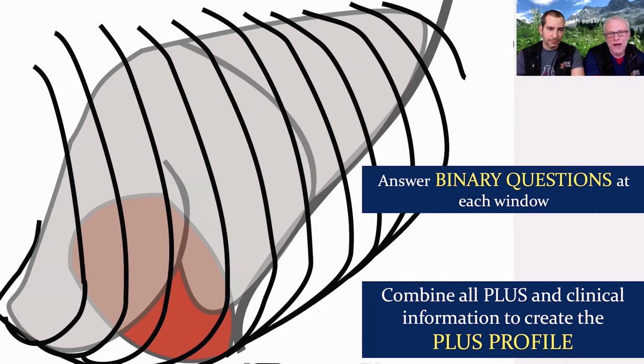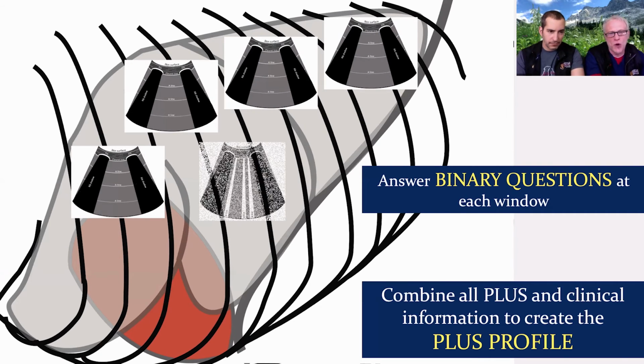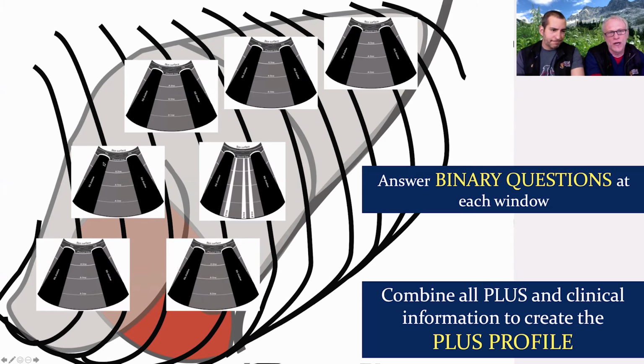So let's do another one. Let's scan this patient again. We're doing each window. What do you think at each window? Are you dry or wet? Well, only one window where I see 3, but by definition, that is okay, especially that it's only one single window, Dr. Boysen. You're correct, Dr. Chalhoub. 3 is rare, but can occasionally be seen.